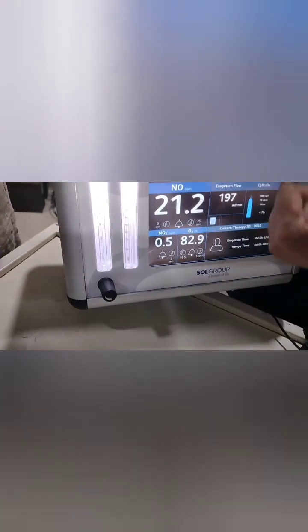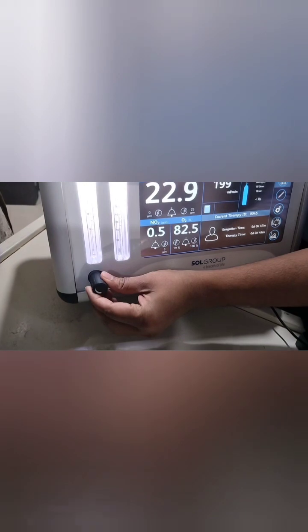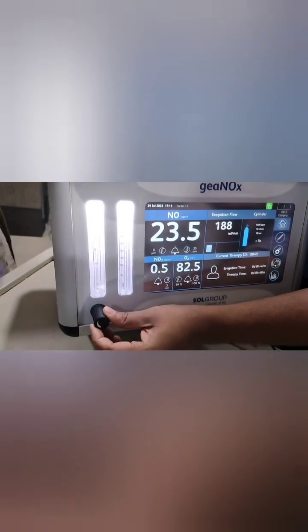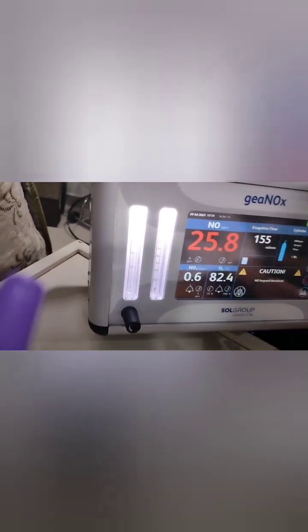I set it to 160 flow and may need to decrease slightly because it is going up. This is all fine-tuning — the calculator gives a crude estimate and you adjust based on what you see. Clinical improvement with iNO therapy generally starts around 20 minutes later.